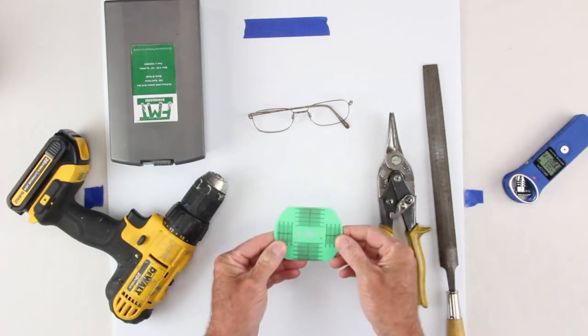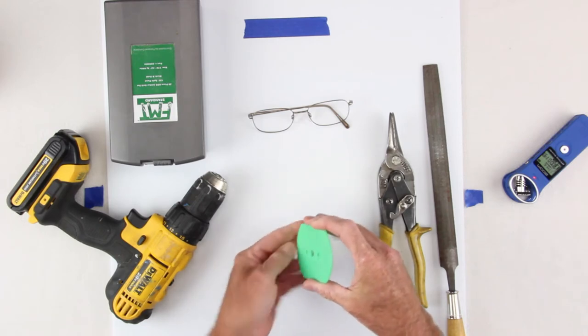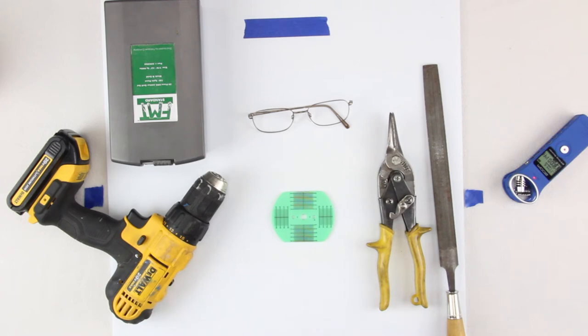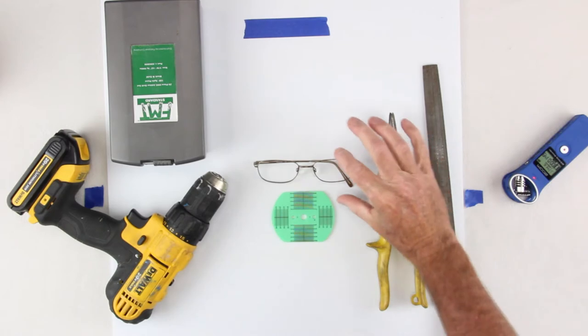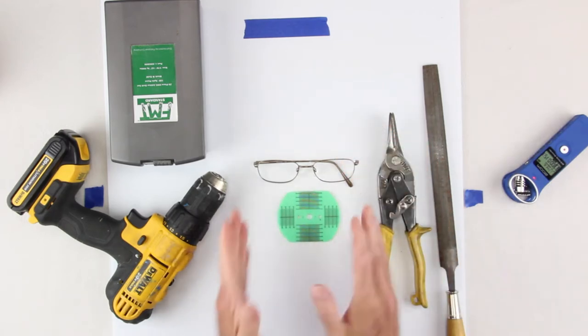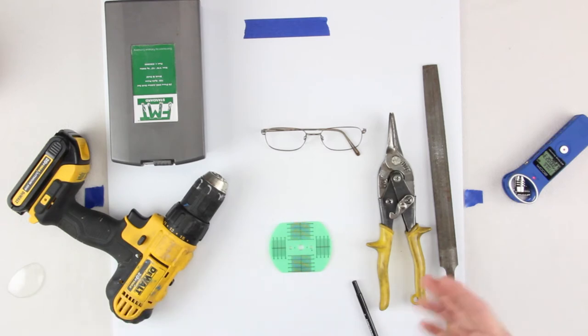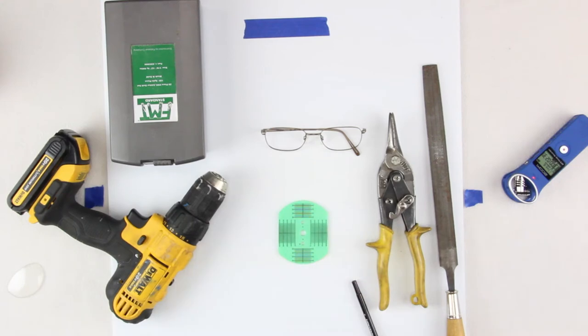This is a lens pattern blank, and you don't see these very much anymore. They are still available, and as you're about to find out, they still can come in quite useful. Most frames obviously are wider in the A than they are in the B, so normally one would hold the pattern this way. What I'm going to do, because this is a very special test that I'm going to be working on, I'm actually going to turn it like this, and my goal here is to cut four lenses in the identical shape, and basically what I'm trying for is kind of like a skull look, okay?